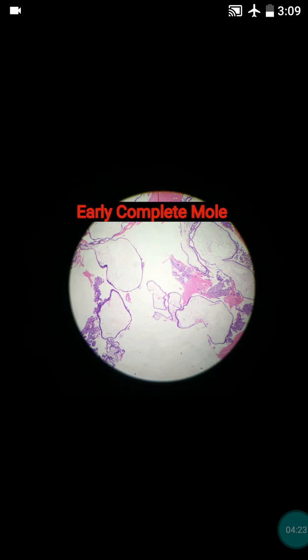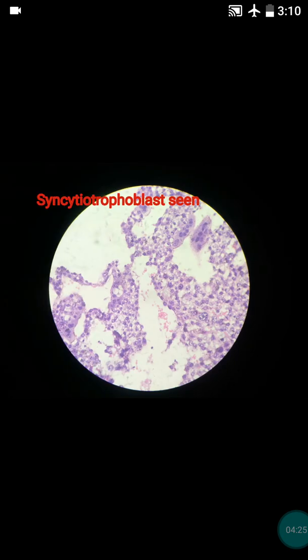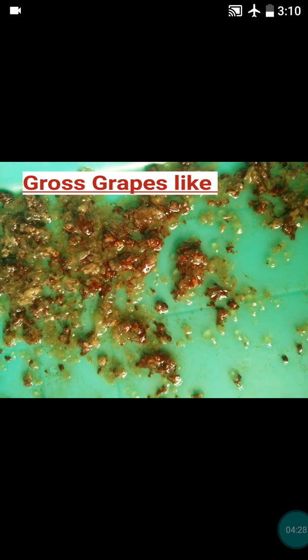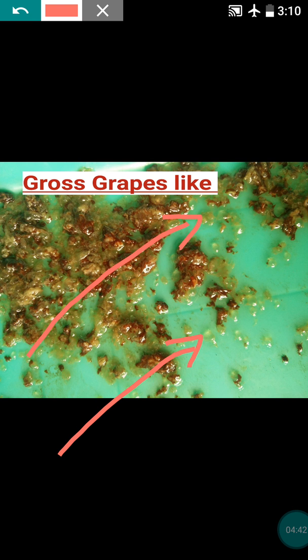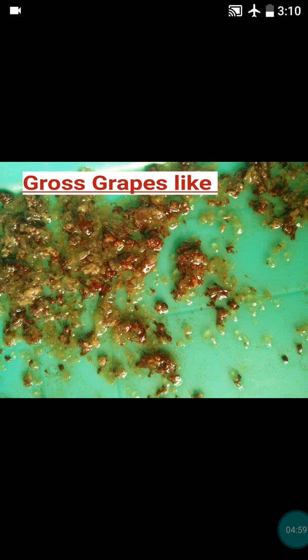Now let's start the discussion of today's case. We have received a grape-like cluster specimen that was received as a vesicular mole. You can see the grape-like clusters of swollen villi — these are water-filled structures. Almost all products of conception were hydropically swollen; grape-like changes are present in almost all structures, and the whole specimen is showing such changes.